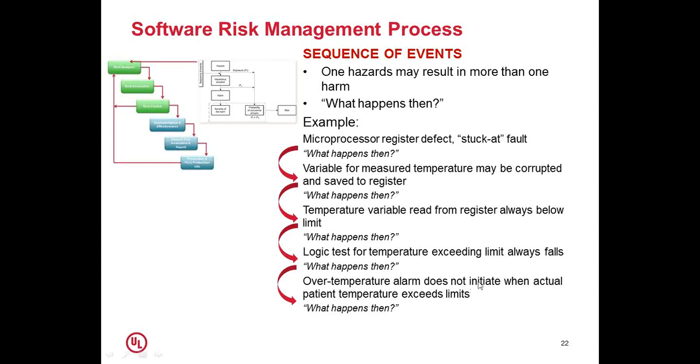This is an example which I would like to recall, specifically in India. Recently, we had a situation where an incubator caught fire. So we can take this example there. The example I put is only illustrative. What could have gone wrong?